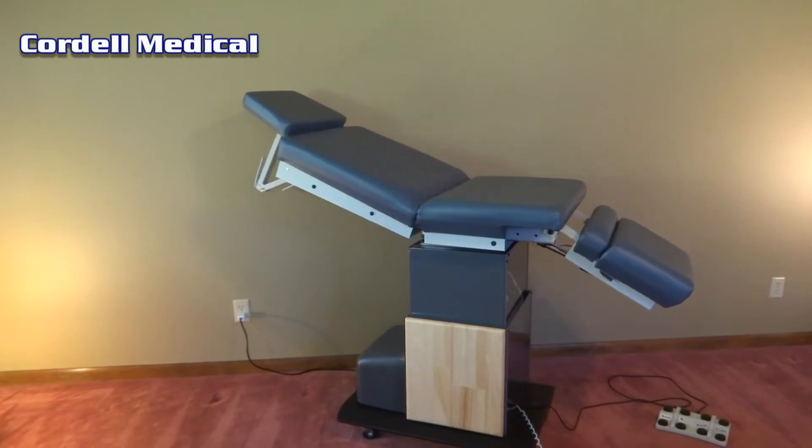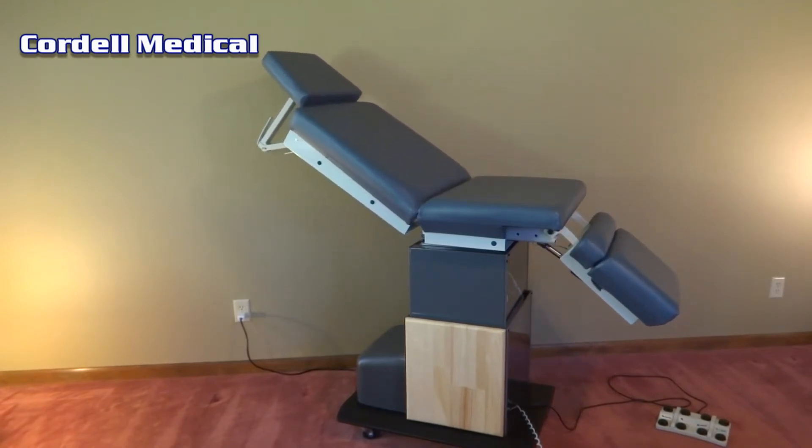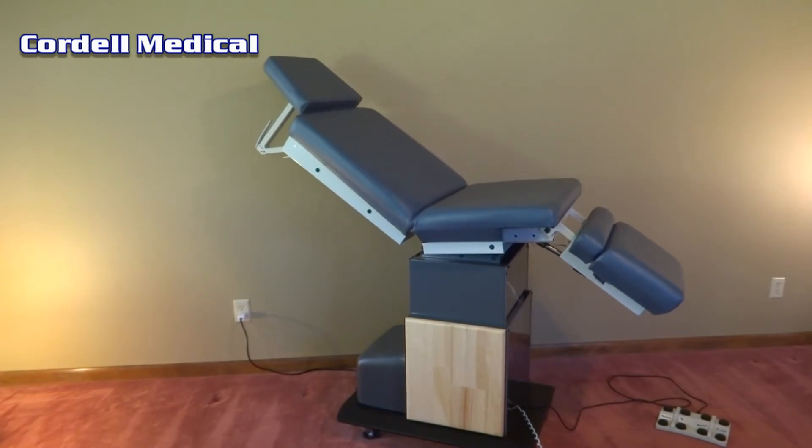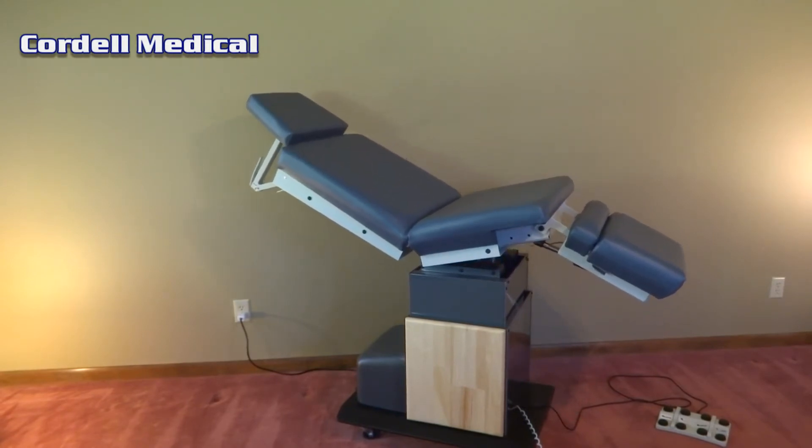A 21-inch custom narrow back and seat can be ordered as well as arm boards and narrow headrests. Warranty is two years.